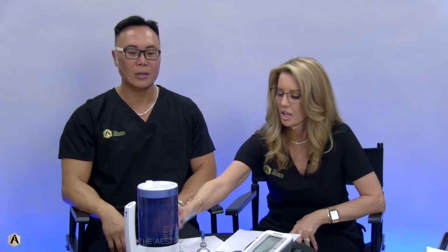I think those are the go-tos when I use my toxins, because I don't like insulin syringes that much, because you have to draw it up through the needle itself. I'm not a big fan of that. And you know what? I think the companies hate diabetics. Those insulin syringes, we use BD and stuff, they're not that sharp. And goodness sakes, if you touch the needle to the bottle when you're withdrawing, like I tell my medical assistant, don't touch the needle to the bottle, because it will dull that needle, and it hurts the patient.